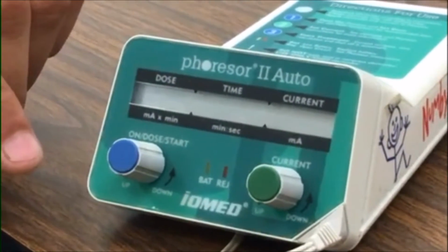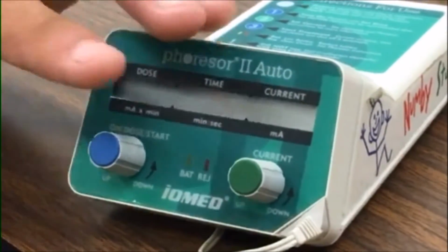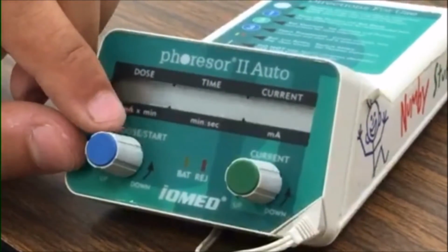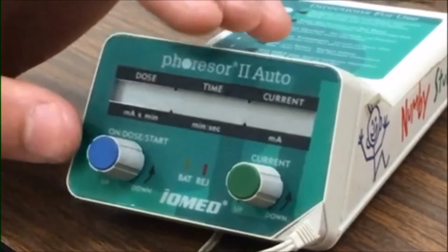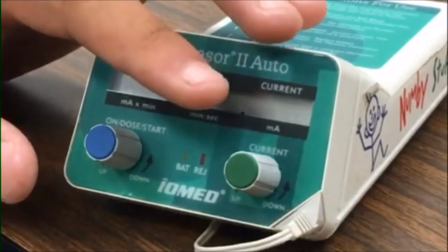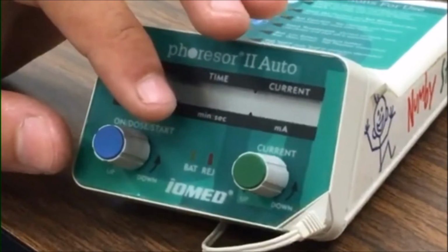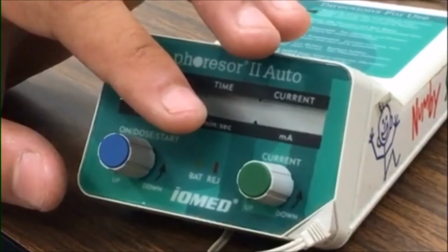Studies show using a dosage level of 40 milliamp minutes with a maximum current of 4 milliamps, which would be adjusted with this one, is effective during delivery while minimizing the risk of burns, as we mentioned before. This machine gives us the flexibility to lower the milliamps to 3, 2, or 1 to accommodate patients' comfort. However, keep in mind that as you lower the milliamps, the treatment time will increase.